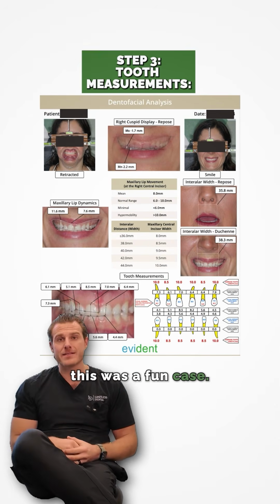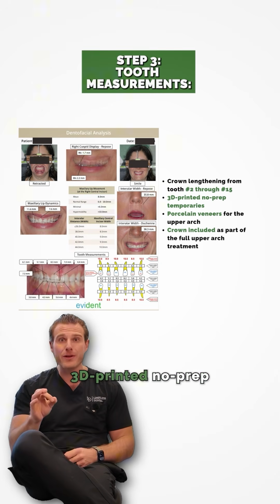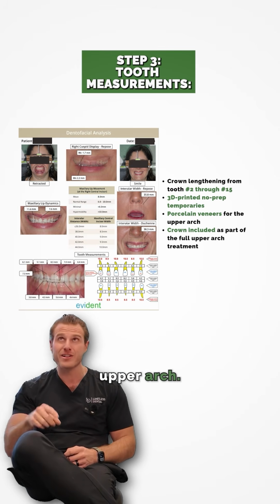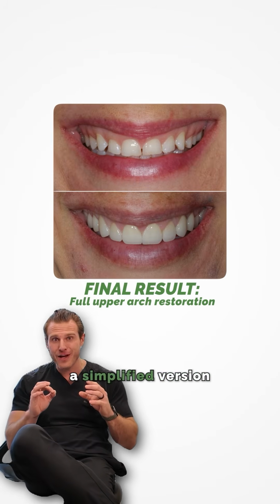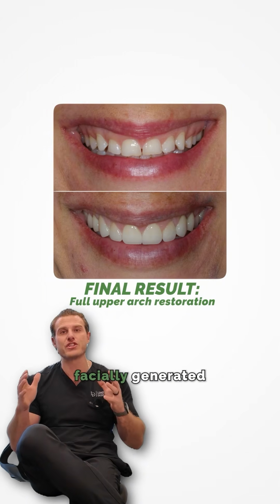All in all, this was a fun case. This included crown lengthening from tooth 2 through number 15. This also included 3D printed no prep temporaries, and then finally porcelain veneers and crown for the full upper arch. This is what it looked like. This is definitely a simplified version of the entire system that I use, but it is a good start for you to get into facially generated treatment plans.